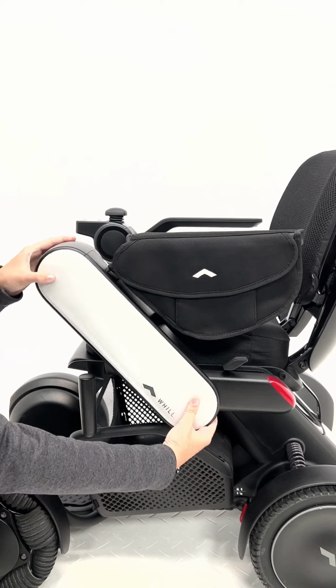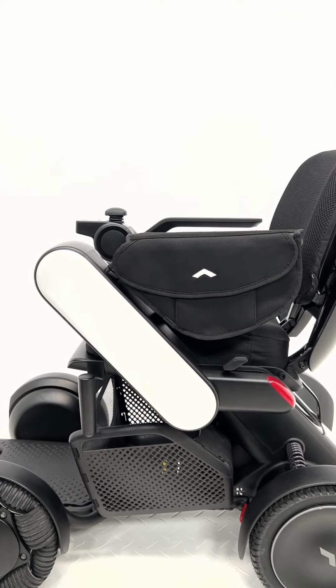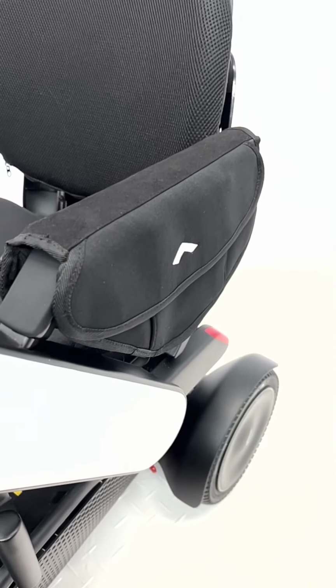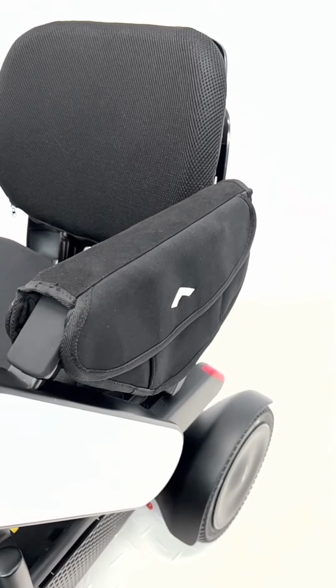Lastly, replace the arm cover and make sure the clips are securely fastened. And that's it! Your sidearm bag is now securely installed and ready to accompany you on your journey.